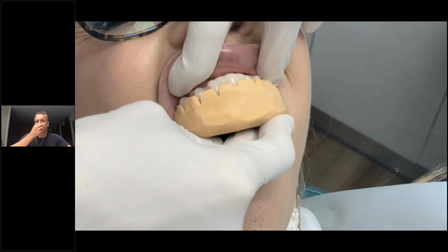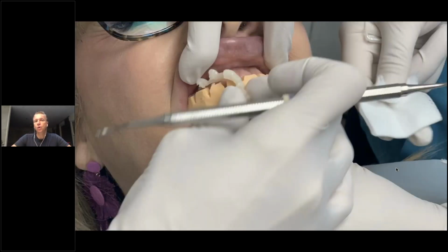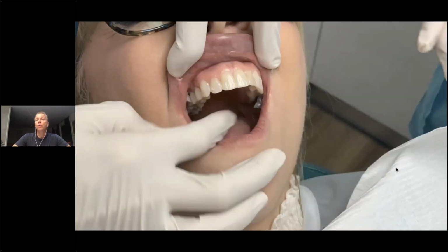So here, that patient presented with different colors, different gingiva levels, very worn, very flat teeth. And her personality is just incredible. She's a fun person. She likes to smile. She likes to sing. She likes to dance. And she would love to show that in her smile. So for her, we started doing the same workflow. M-Smile, we went through the whole smile design process and then made a digital model, and were able to make a matrix from that model to show her live how her smile, what we had in mind, could look like.